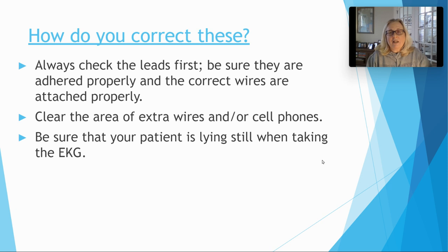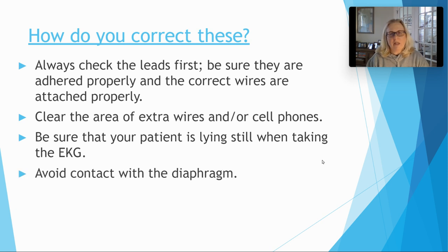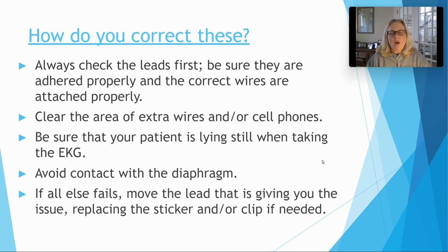Take a nice cleansing breath and relax your whole body, arms and legs, everything included, and just head back to it. It's really important the head's back so that you can lay nice and still and you won't get any artifact from that. Avoid contact with the diaphragm. I said that several times. If it fails, then you need to most likely move the lead stickers, the limb leads.